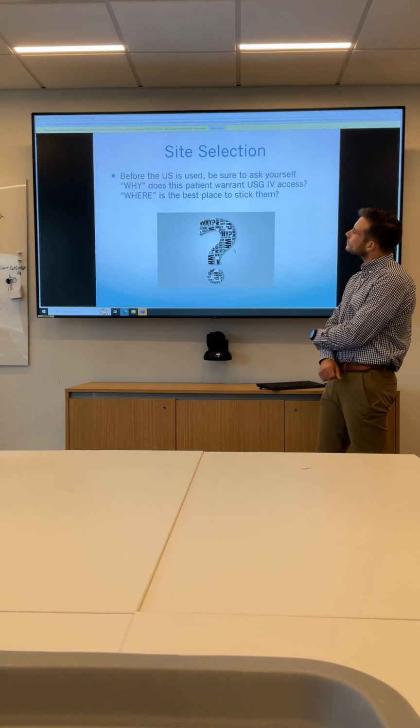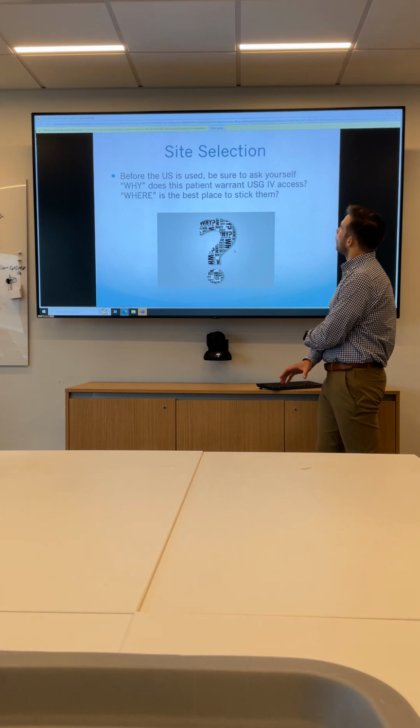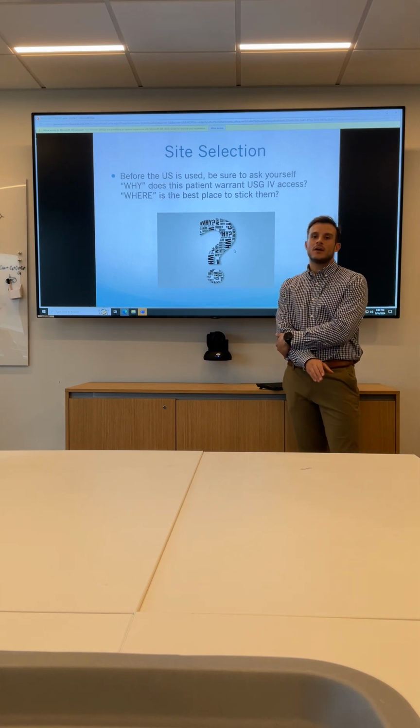Site selection. Before the ultrasound is used, you want to be sure to ask yourself why and where. So why does this patient warrant an ultrasound-guided IV access?